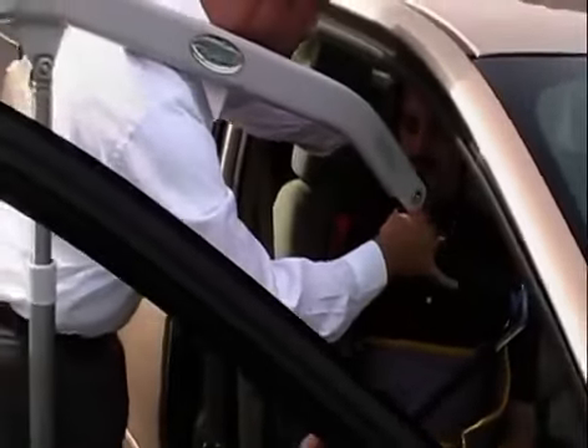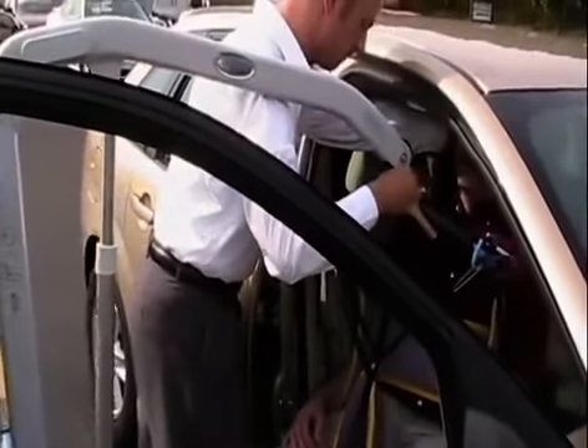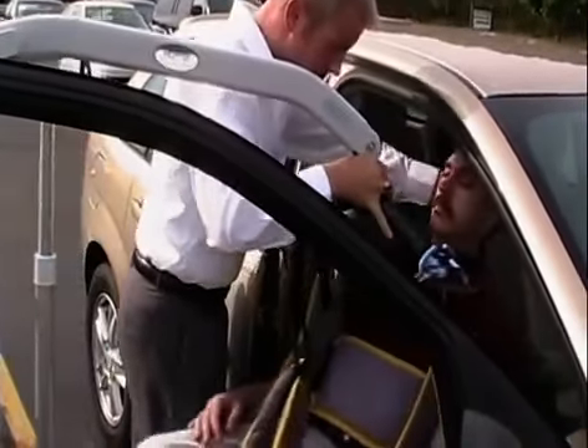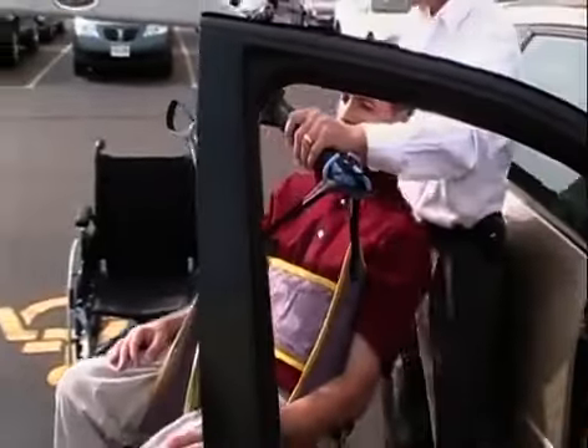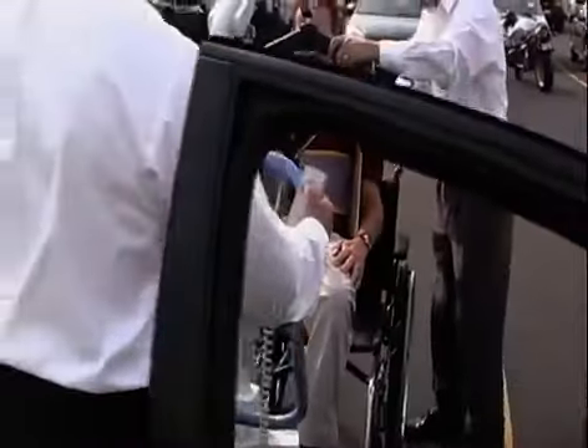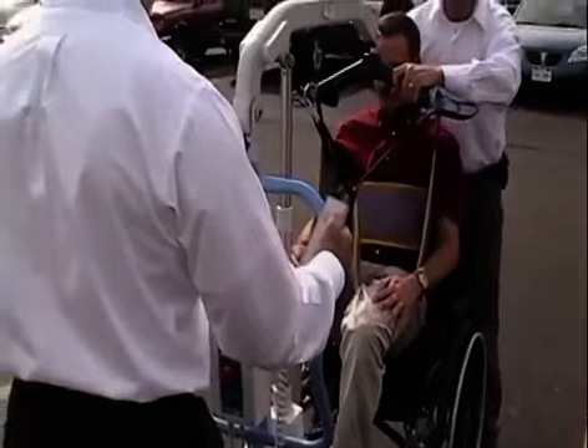We're going to go ahead and back up, and we're going to start lifting you out. Go ahead and lean back. I'm going to lift you out, and doing so, we're going to pivot you here. I'm going to put you right in the wheelchair. I'm going to go ahead and make sure that we lower you down so that you're comfortable and fitting in it good.